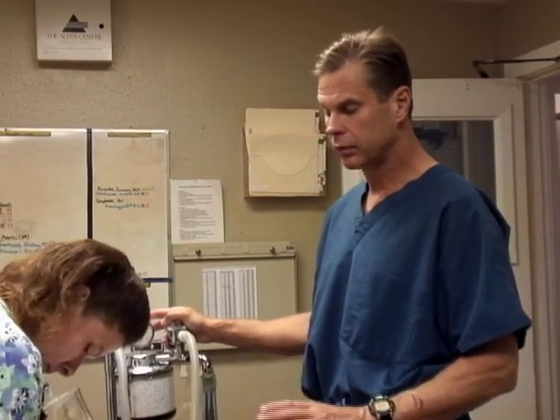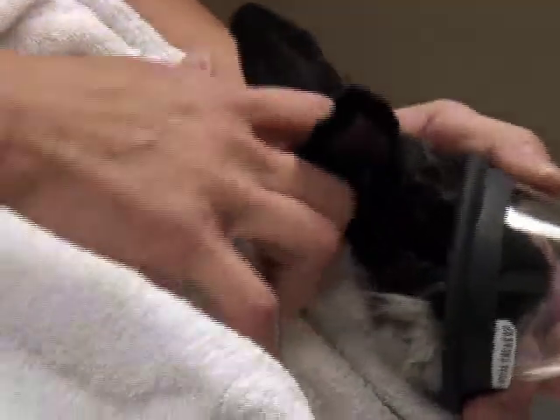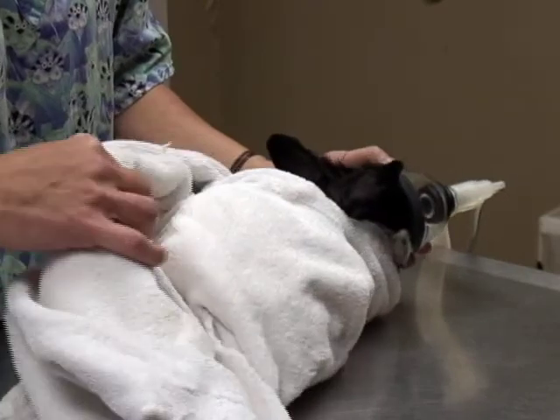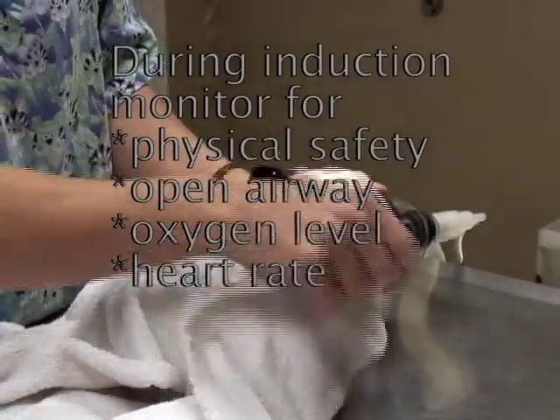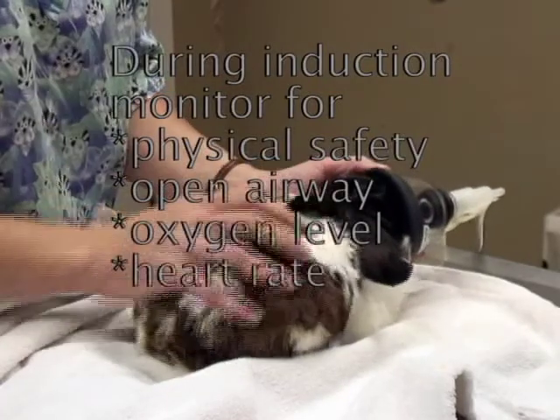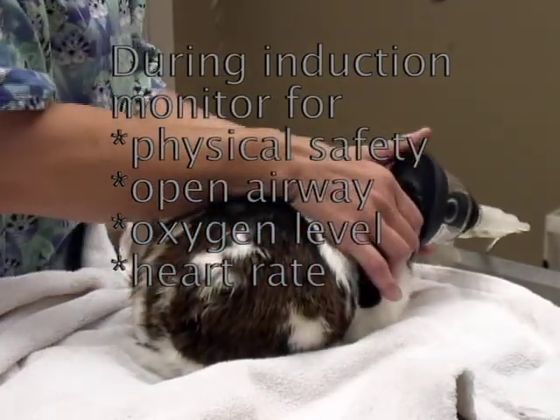Dieter has him wrapped, we've got a little mask over his face, and he's breathing oxygen and sevoflurane. One of the things about sedating a rabbit is you want to be very careful as they're going into sedation, that they don't hurt themselves during induction — which is why we had this guy wrapped up. You need to make sure that they maintain an open airway and that they're getting enough oxygen.